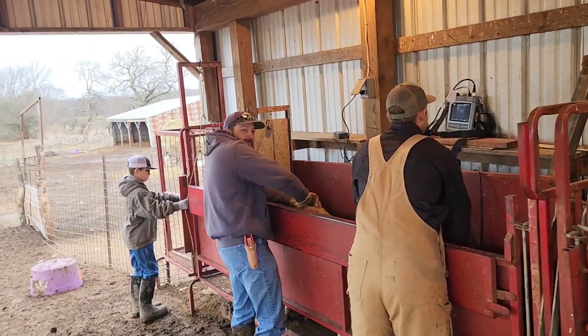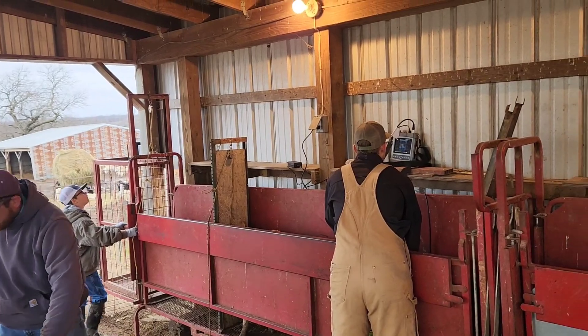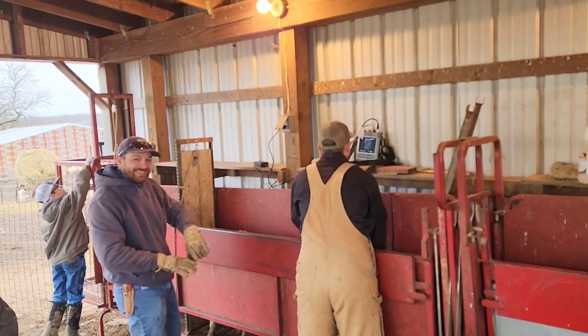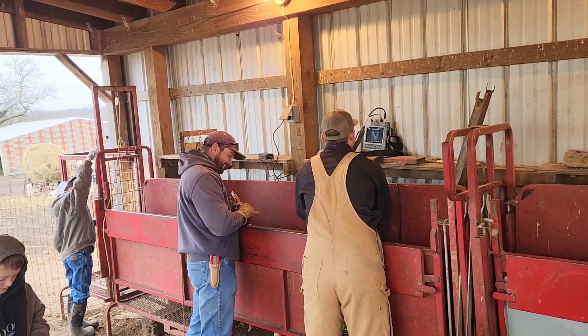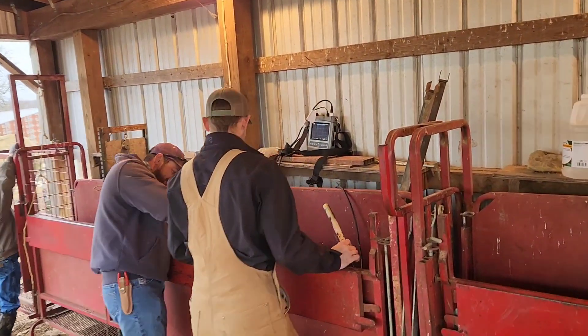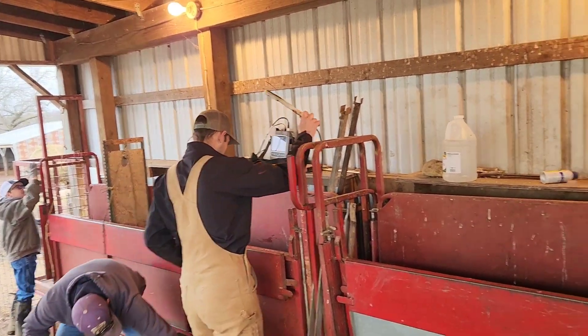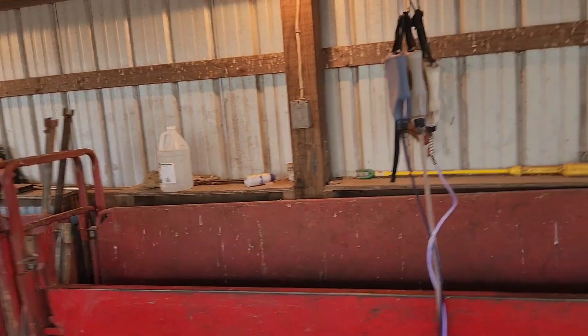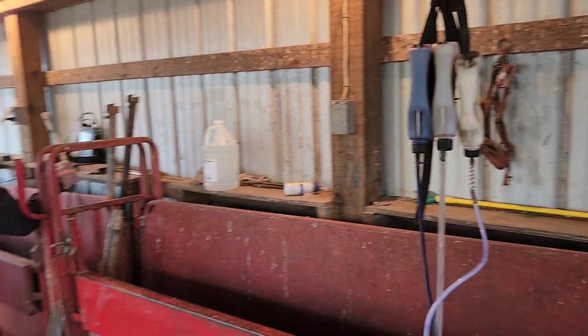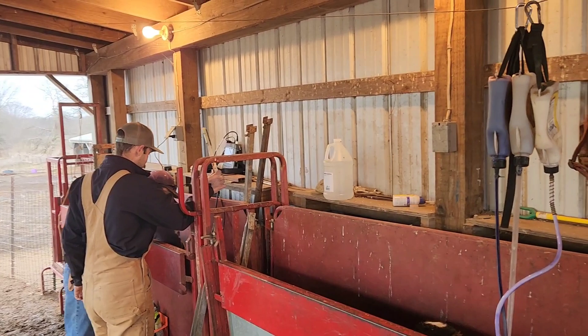Every once in a while we get a wether run through and we try to trick him to see how good he really is. He called him open this time, but we'll see — we might have snuck a few more in there just to test him. We're also FAMACHA scoring them and worming the ones that need it as we go through.